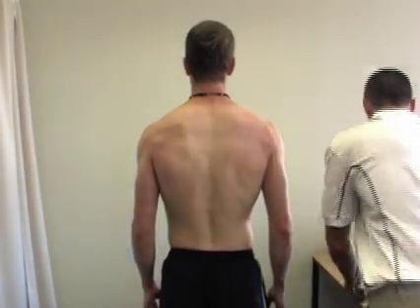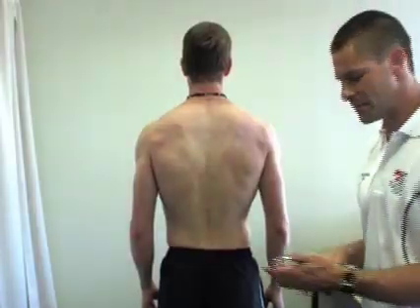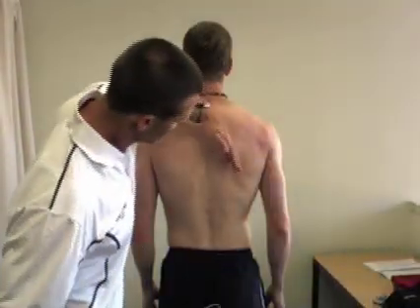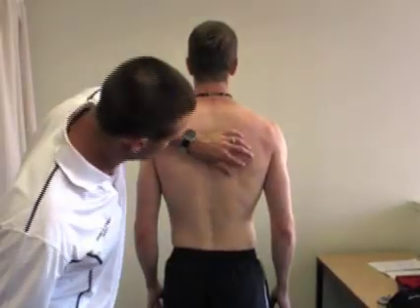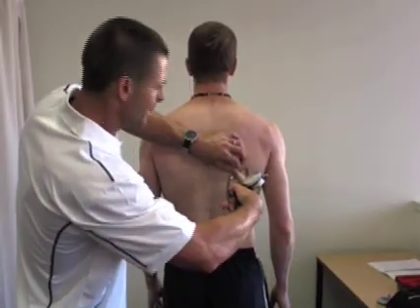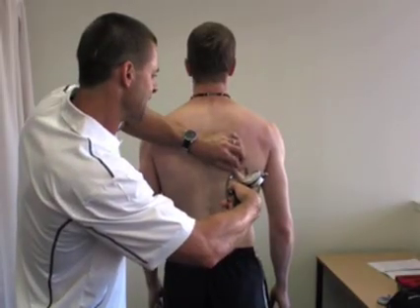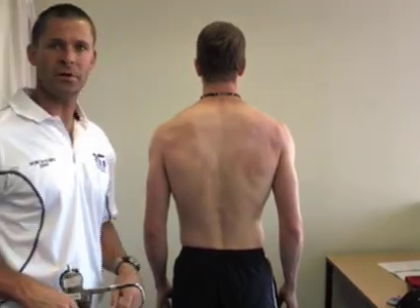Once we've got that mark made, we position ourselves comfortably and take the fold going up at the same angle as the inferior angle of the scapula. We grab the skinfold, take the measurement which today is 7.6mm, then take it off and rub off just like so.